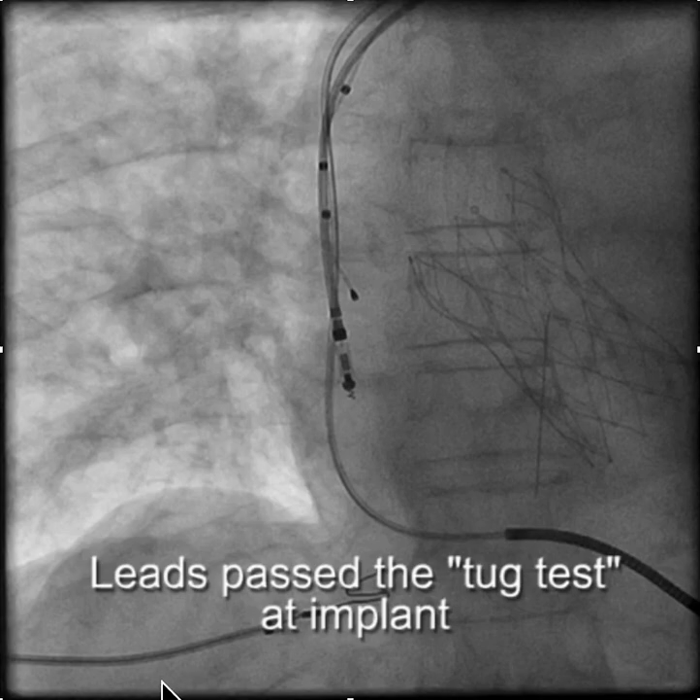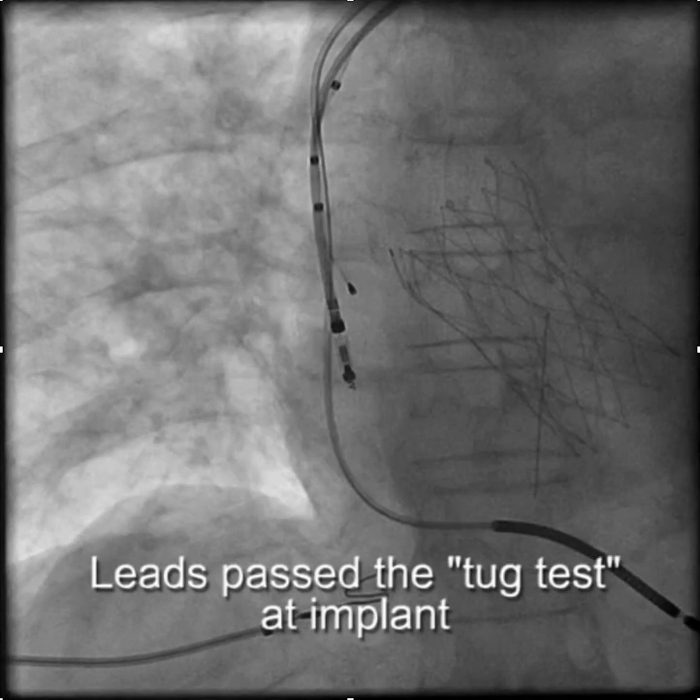When you see this after you've done an implant several weeks later, it's extremely frustrating and you wonder what happened. At the time of implant, you tugged on the leads and they seemed to do just fine, but now you have this situation where the leads are pulled back.